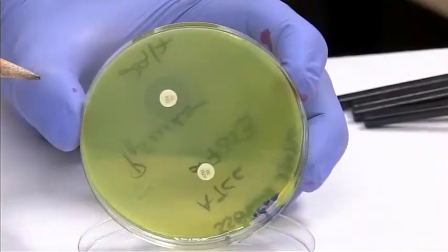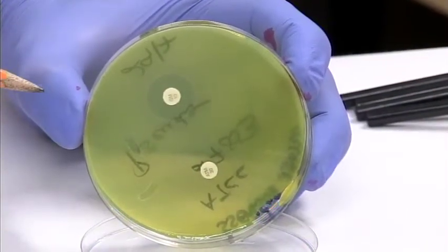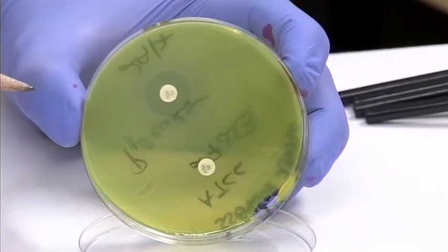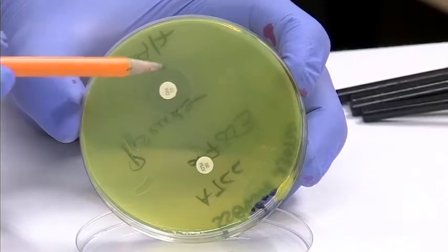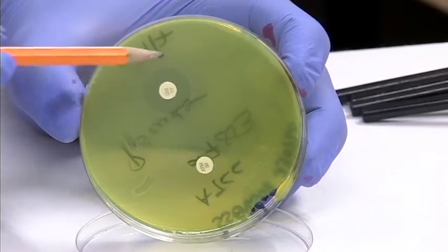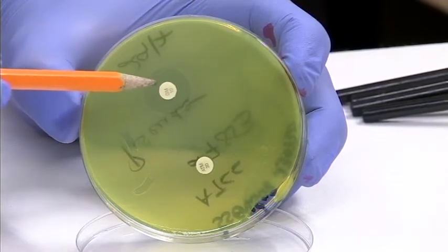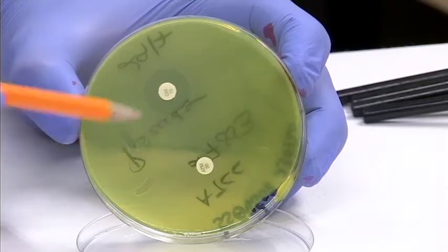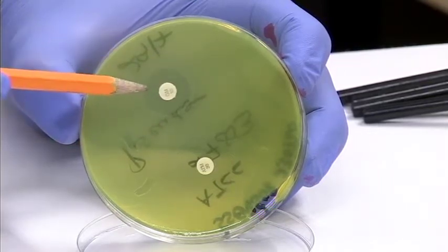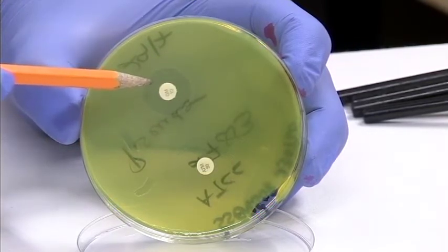So here we have a reacted sensitivity plate with our bacteria, Pseudomonas aeruginosa. And you can see we have two antibiotics here. On the top one, you can see a clear zone around the disc. Now, what would have happened overnight is that once you placed the disc there on the previous day, the drug started to diffuse radially outwards, and the bacteria is trying to grow at the same time on the surface of the plate.